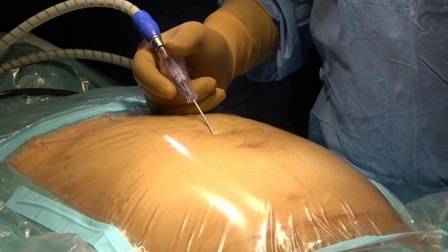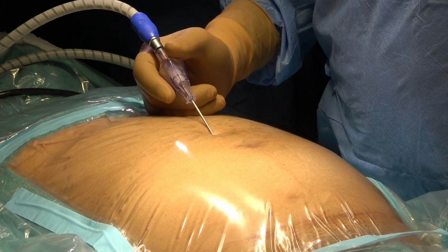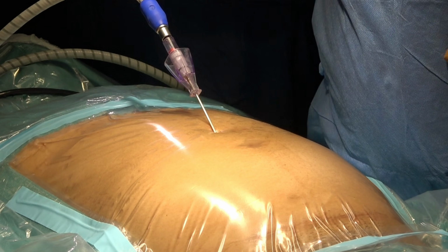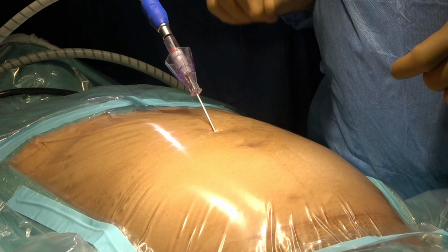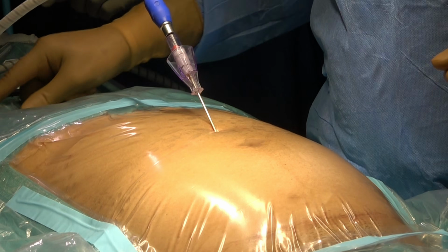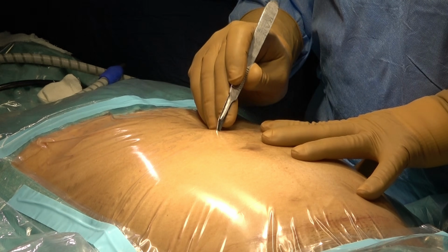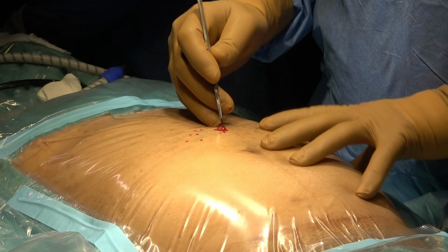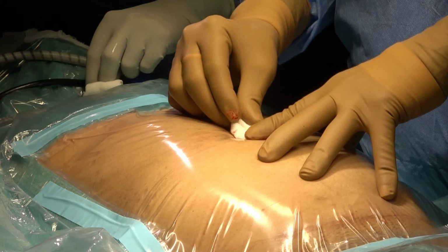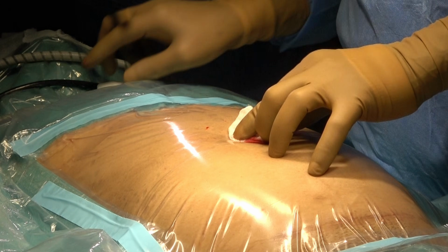So we can see that insufflation is started slowly, and we are keeping the preset pressure at 15, the actual pressure is slowly reaching 15, and we can see homogeneous distension starting in the abdomen. And when you do that, you should be very careful. Here we are using the 10 port for the telescope, and we will use only a 5 port, on the right iliac fossa, for the diagnostic laparoscopy part.